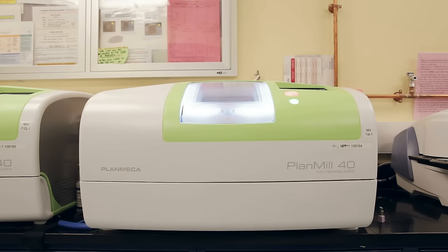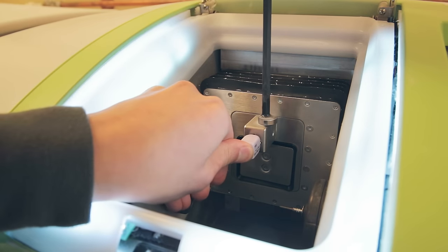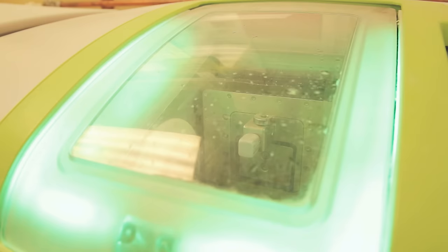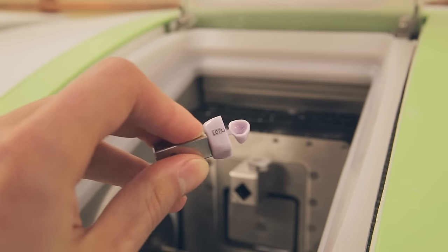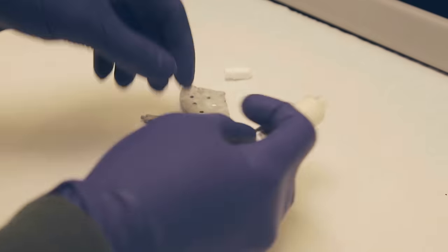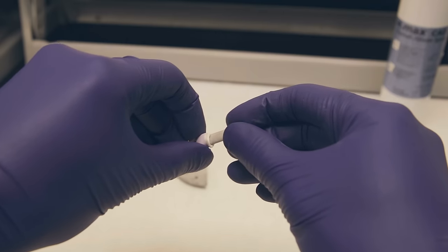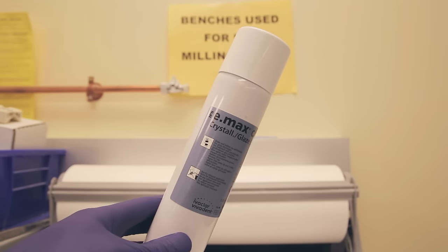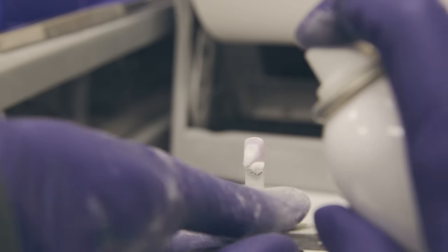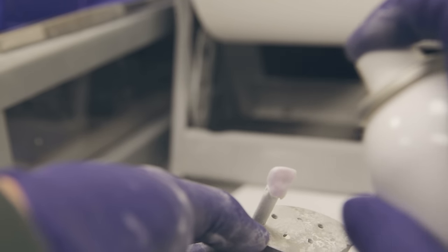The design will now be sent to the mill. The Emax block should be firmly secured into the mill in the appropriate orientation indicated in the PlanScan software. Once the crown is done milling, remove the sprue with a handpiece and inject some object fix into the intaglio surface. Place the crystallization pin into the object fix and glaze the crown with Emax glaze spray until the crown is frosty in appearance. Alternatively, a rubber polisher can be used to give the crown a nice shine after it has been baked.